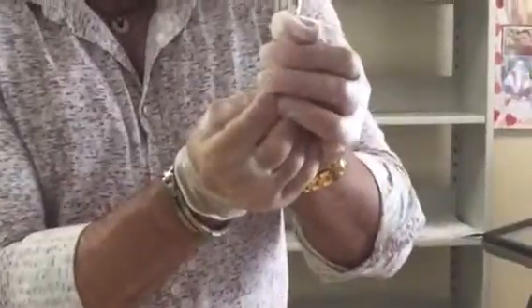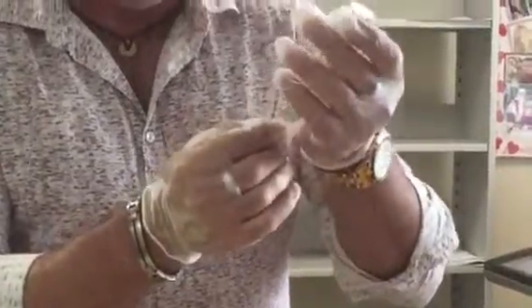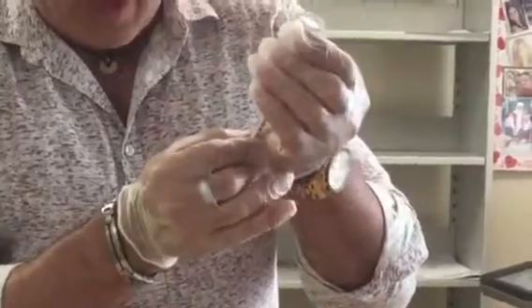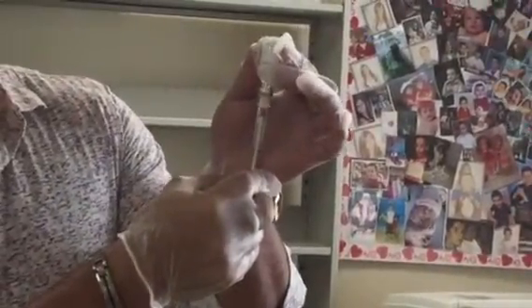Take the cap off of the needle, pull back the plunger of the syringe to put as much air in the syringe as the dose you want to use of the medication. Put the needle in through the rubber top of the insulin bottle. Push the plunger so the air goes into the bottle and turn the bottle upside down.